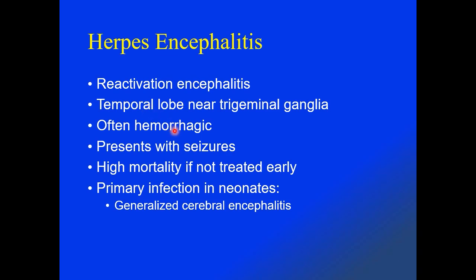They're often hemorrhagic. Patients frequently present with seizures, and this entity is associated with high mortality if not identified early and treated. In neonates, where they may present with primary infection, the encephalitis is more generalized within the cerebral hemispheres and is not localized to the temporal lobe as it is in adult patients.